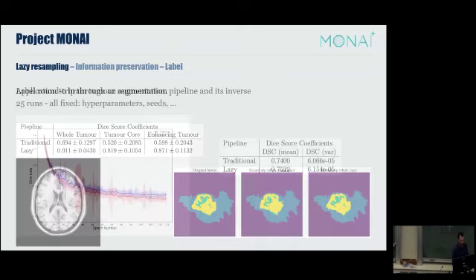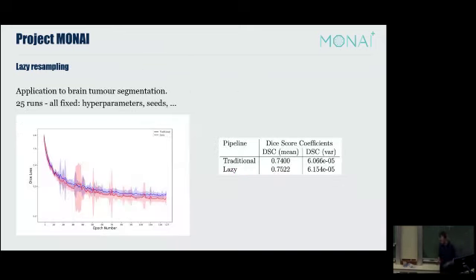And then the final one on this one. We took one common task, which is brain tumor segmentation on an open source challenge called BRATS. And then we used a standard implementation. UNet is something quite popular within our field. That's an autoencoder type of shape with some skip connections in between. It doesn't really matter, but we took one common network used in our domain. And then we tried to do multiple runs.